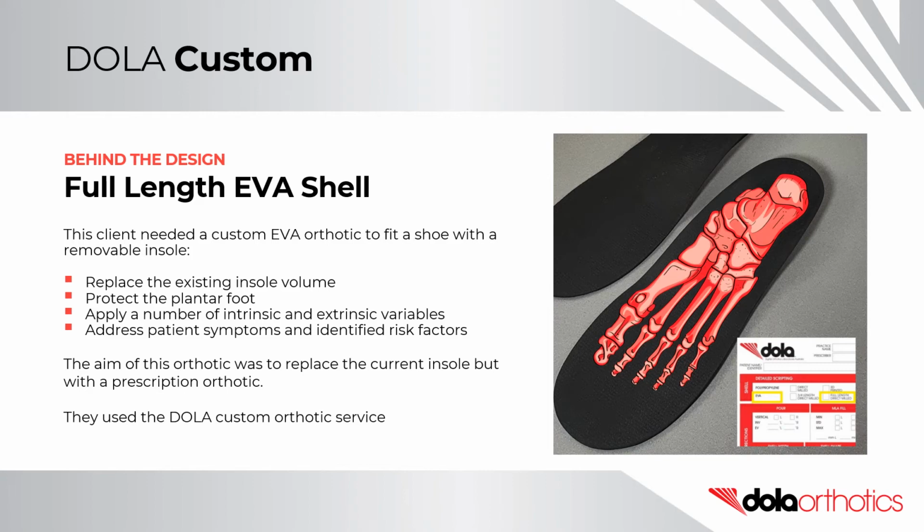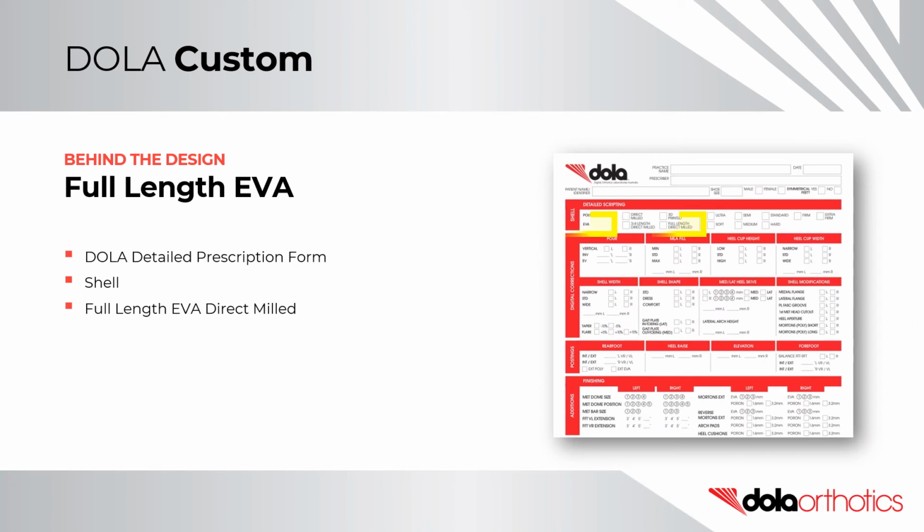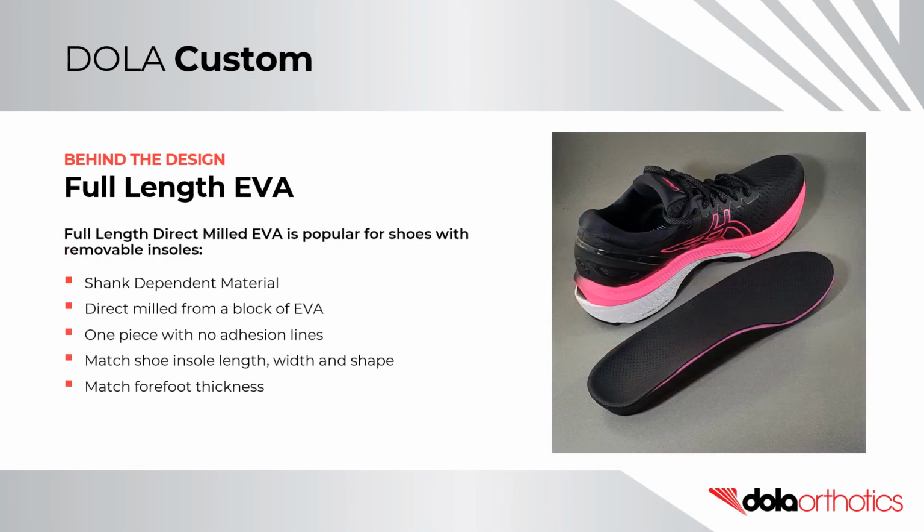They used the DOLA Custom orthotic service. They selected the full-length EVA direct milled shell from the shell material options in the detailed scripting section of the DOLA Custom prescription form. Full-length direct milled EVA is a popular choice for shoes with removable insoles.